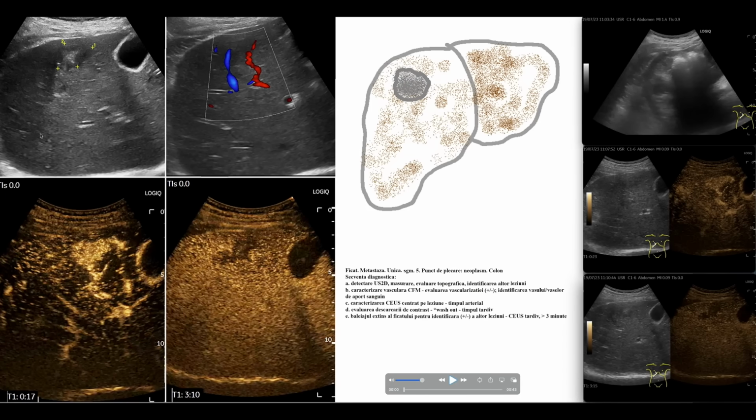The rest of the liver parenchyma is homogeneous. You can also see the liver capsule very well defined without deformities, suggesting that there are no tumor formations under the liver capsule, and also the gallbladder. Returning to the solid tumor formation detected in a patient with colon neoplasia, it suggests metastasis with high probability. The tumor is found in the right segment V site.